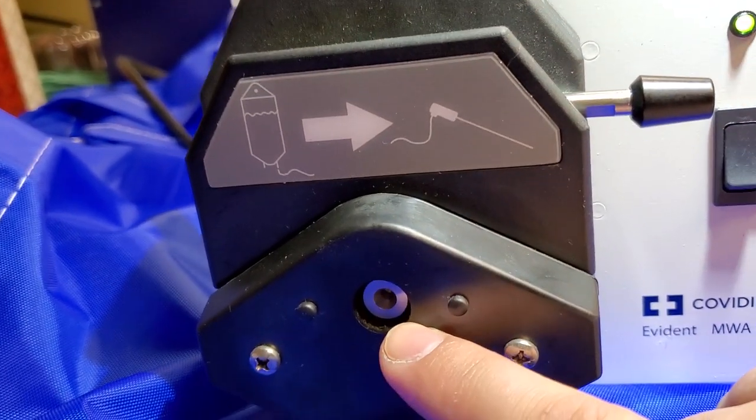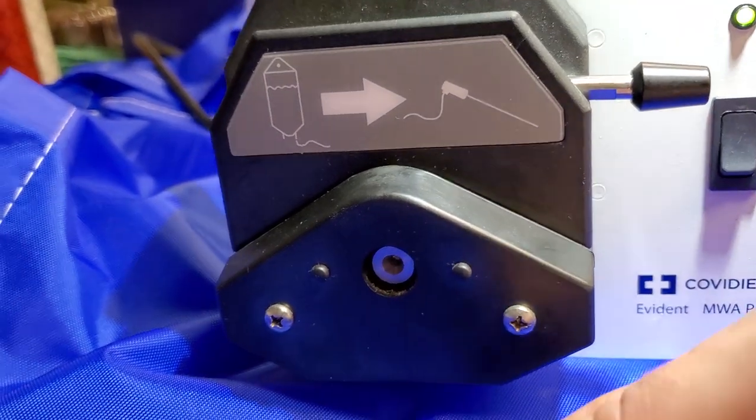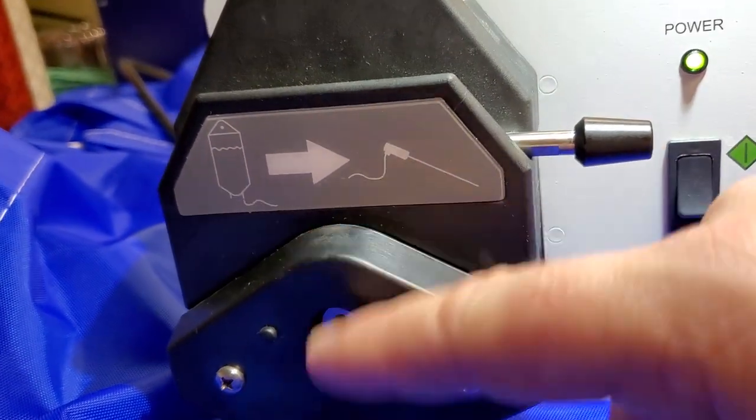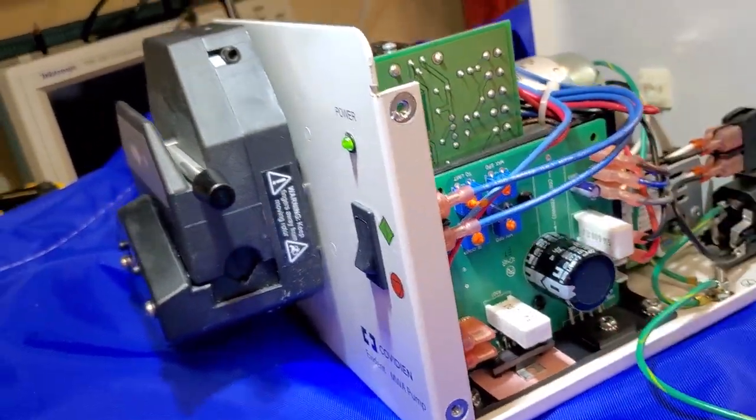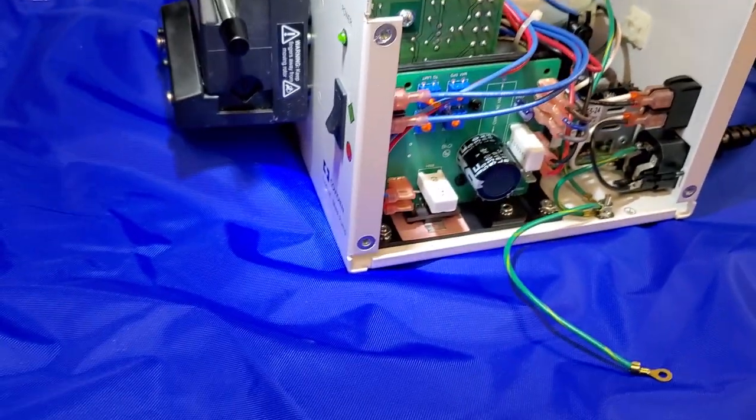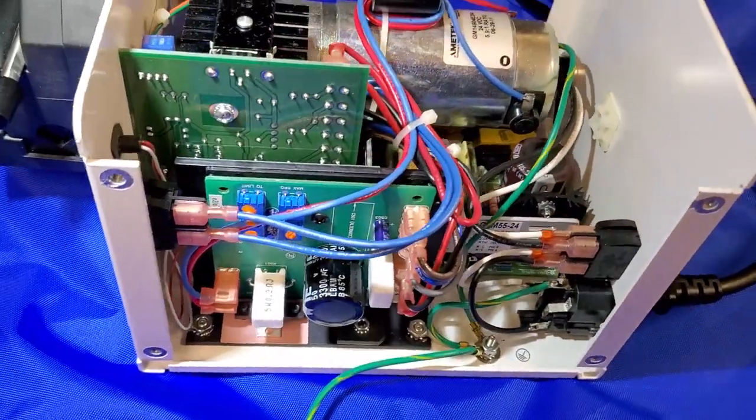This little spot right here is so that you can put a contact tachometer on there, and you can calibrate right here. You can calibrate the speed of the pump, which gives you your flow output.